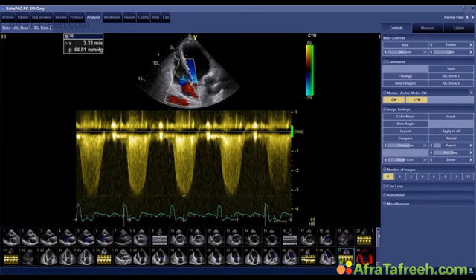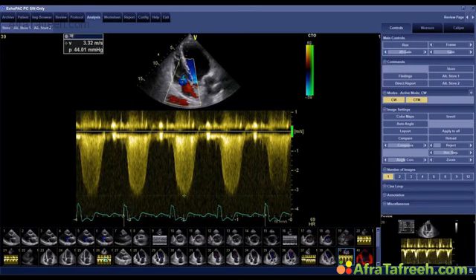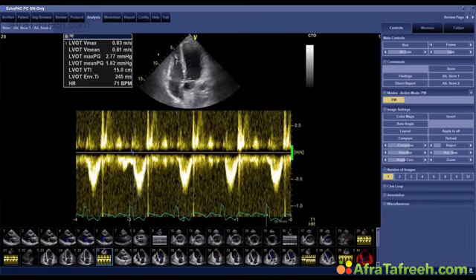But one thing is very interesting, and that is the fact that he has a fairly low velocity across the LVOT. You see, the velocity time integral here is only 15, which is low. You should have 20, 25, maybe 30, 35. That's what the normal velocities would be, which means that there's not much blood ejected. So he has kind of a forward failure, which might also be due to the fact that he is regurgitating most of the blood back into the left atrium.